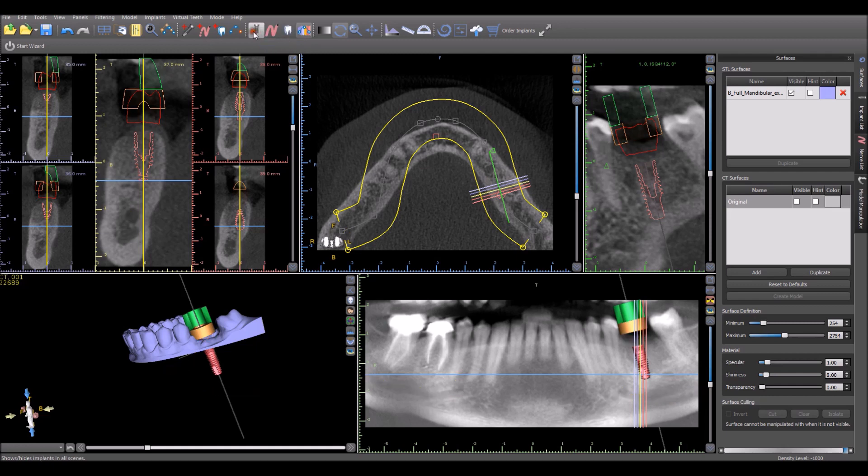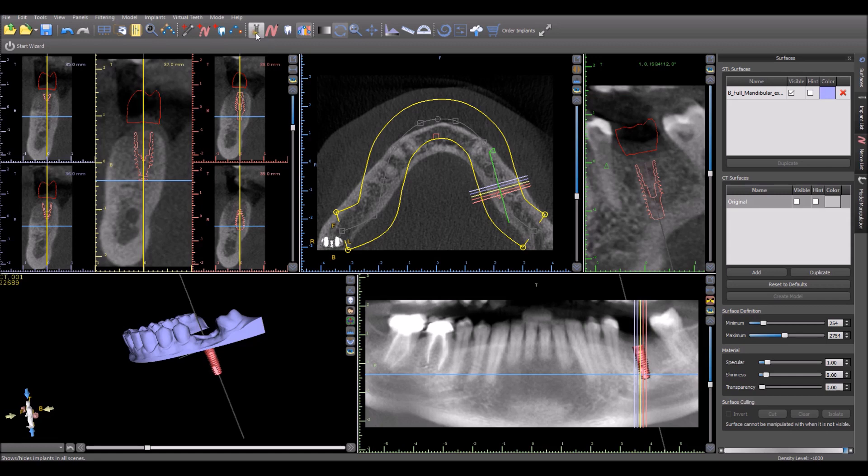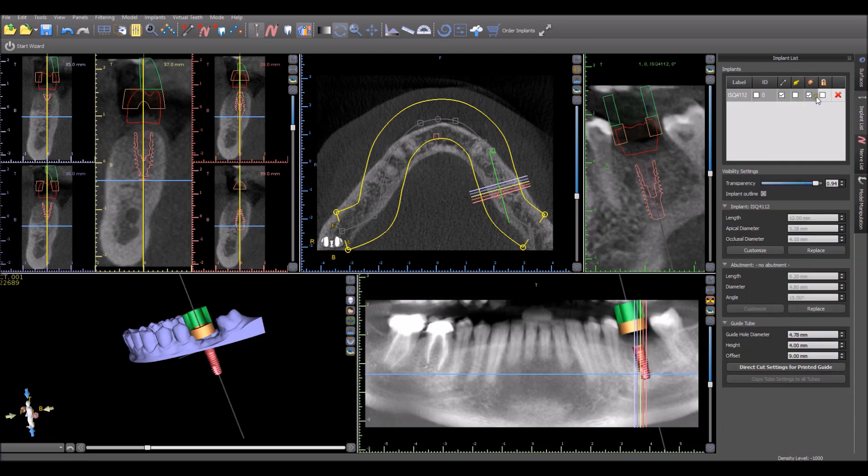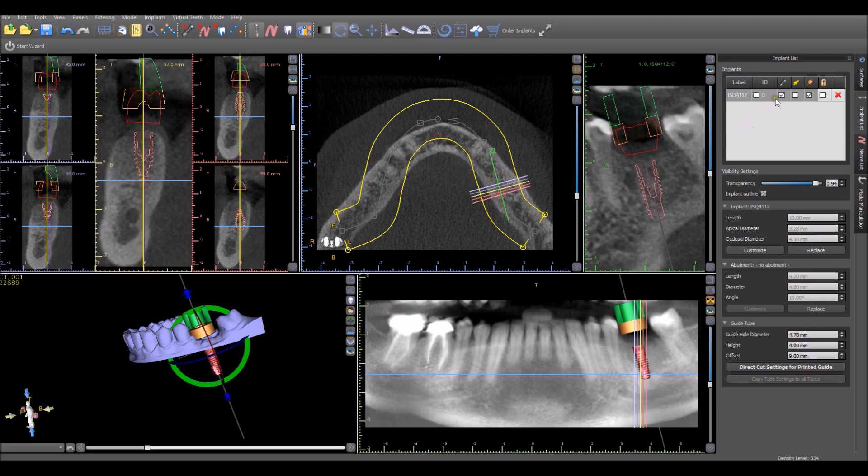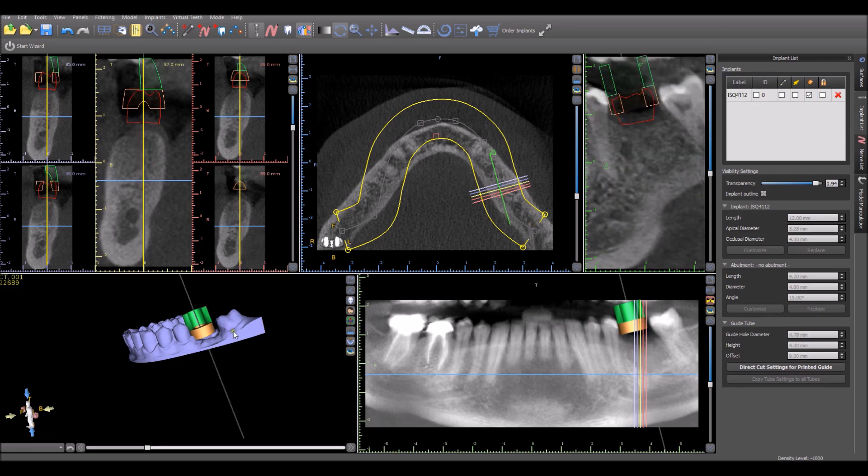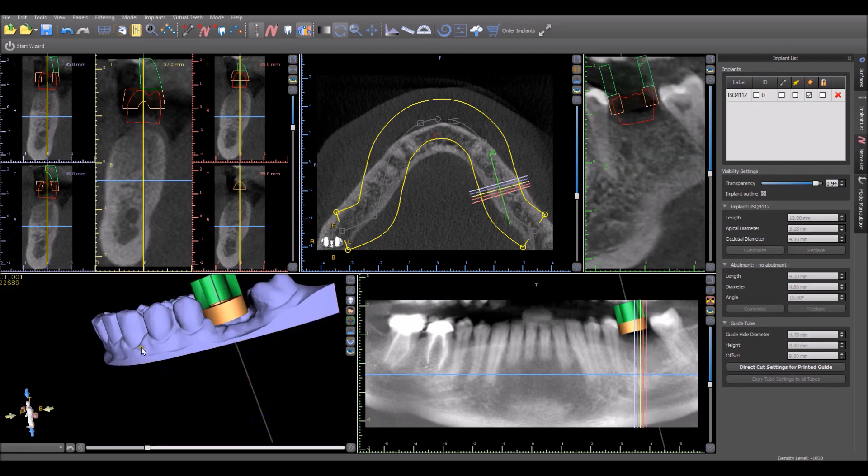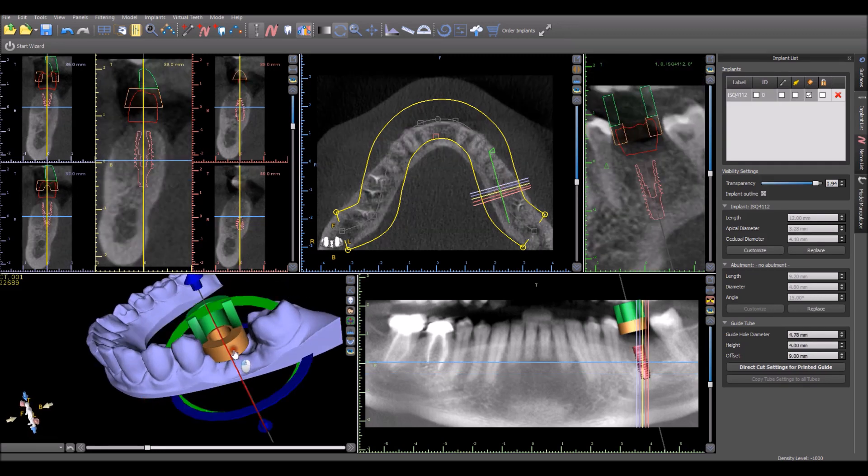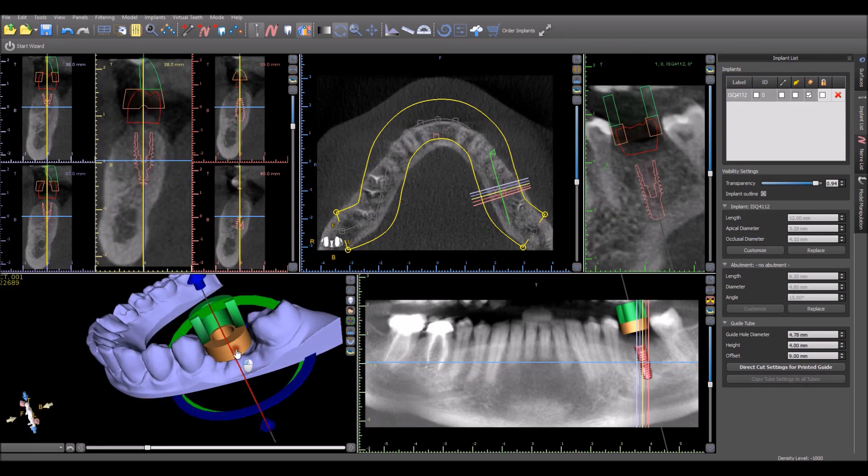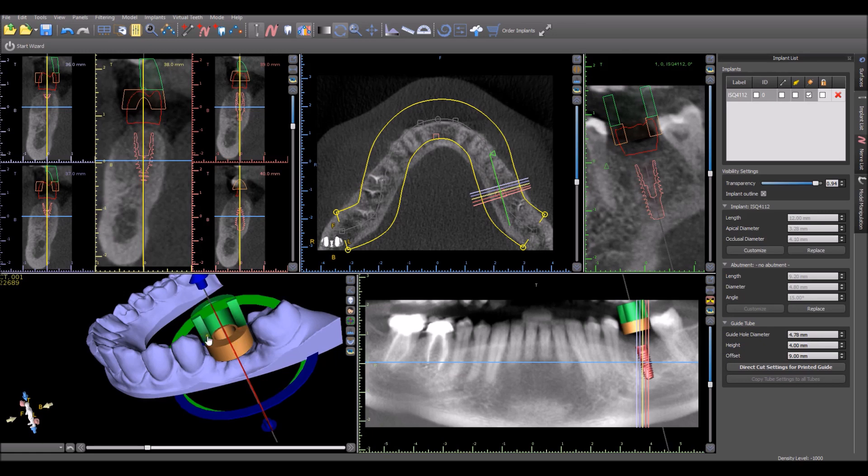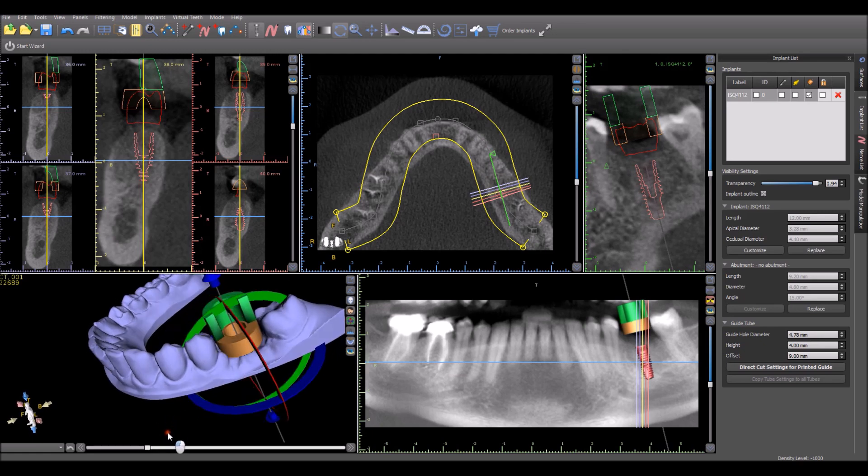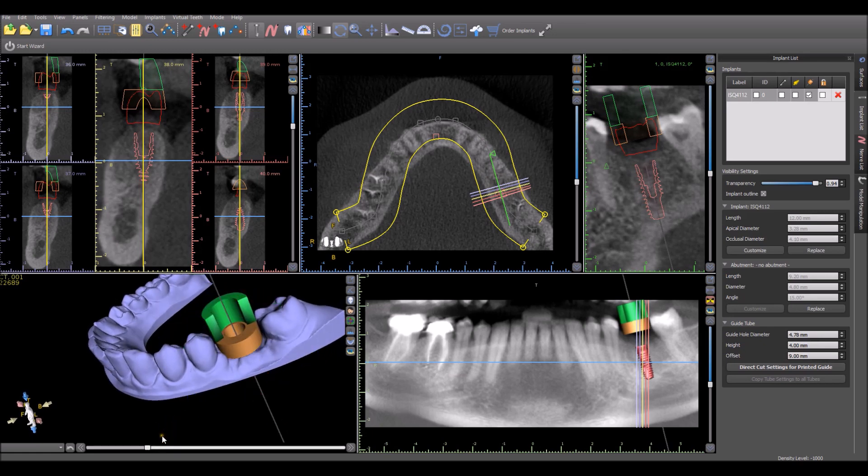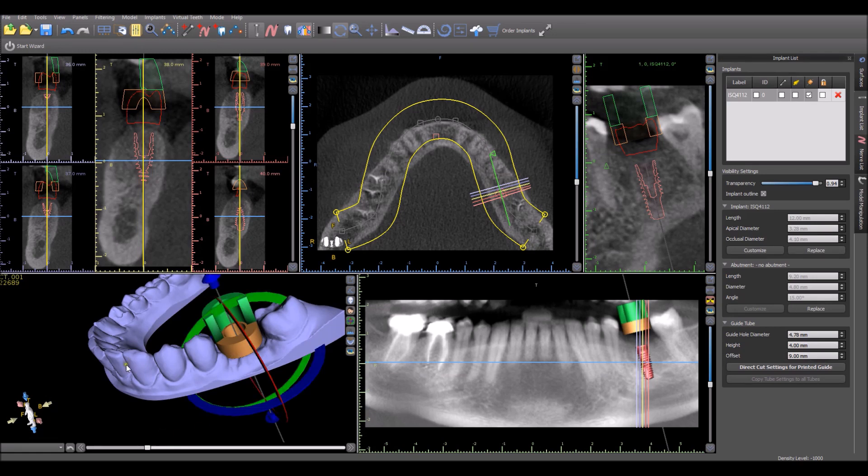Okay, so we can hide everything. We can hide everything that we don't need except the software guide tube and the model. Okay, the software guide tube is our brown cylinder. And what we have coming up from the brown cylinder is our printed drill stop. That's going to control the depth of the drill to make sure we go exactly to the correct depth. At this point, we're ready to design our surgical guide.